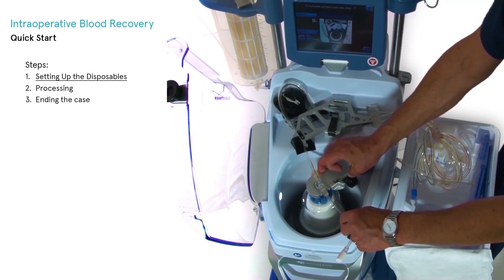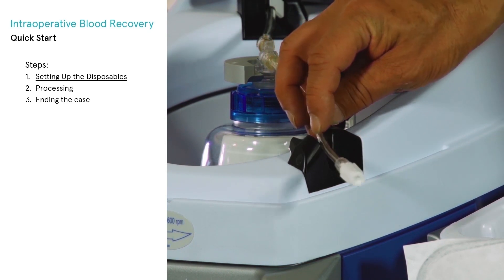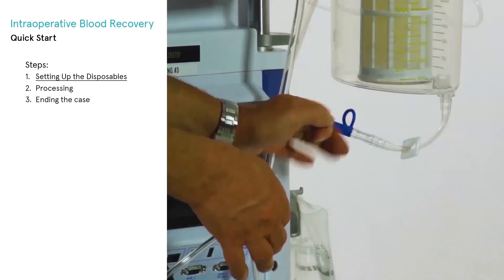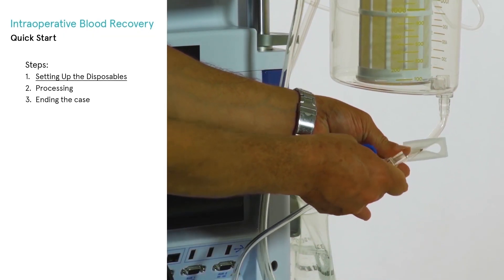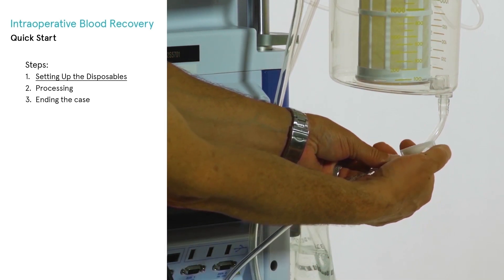Close the centrifuge arm by swinging it forward and insert the wasteline into the wash quality sensor. Close the centrifuge lid. Connect the blue-striped fill line to the reservoir outlet port and ensure the reservoir outlet clamp is open.